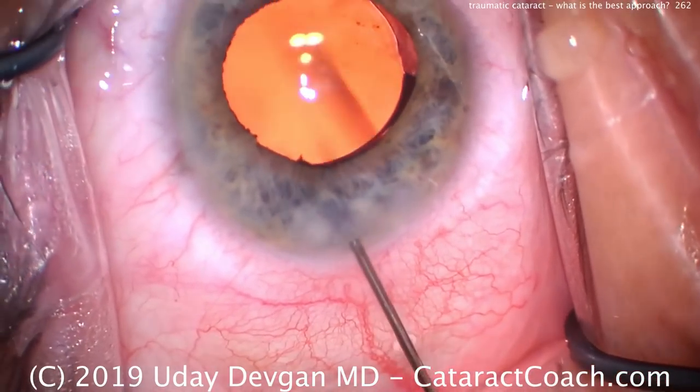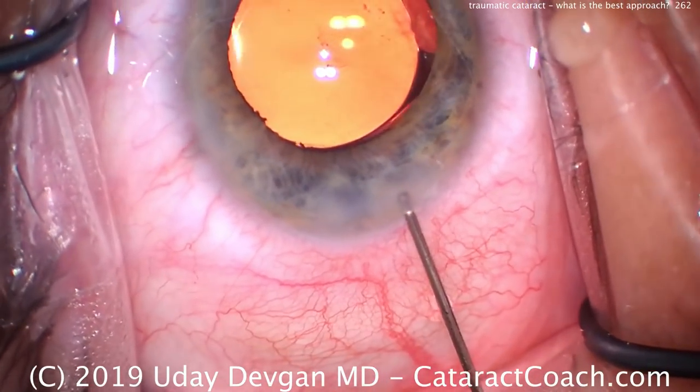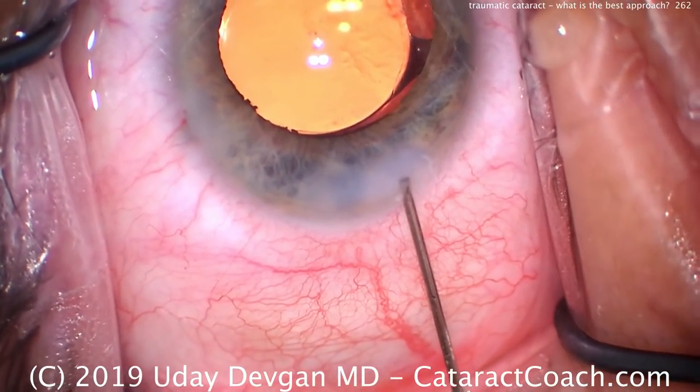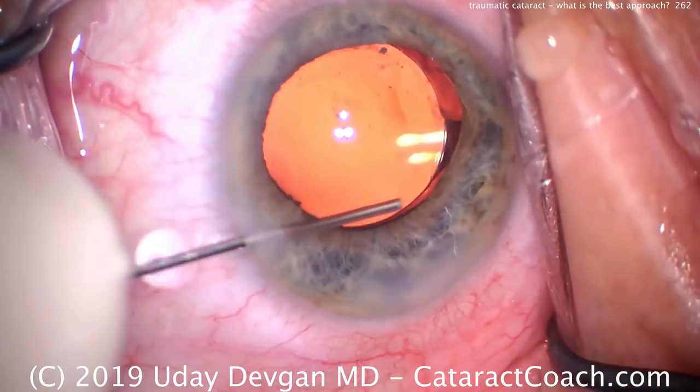Anyway, let's finish our case here, sealing up our incisions. Everything looks beautiful. So we got very lucky here. The patient got lucky. Traumatic cataract, but the rest of the eye was normal. We learned some important lessons, getting that rexus around the fibrotic area of the capsule.